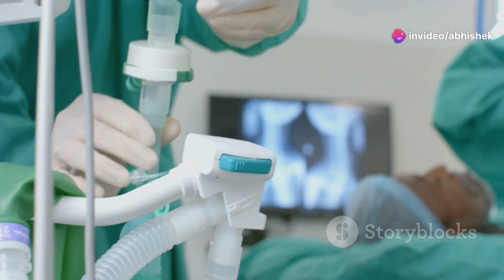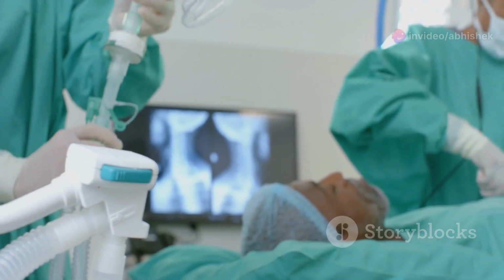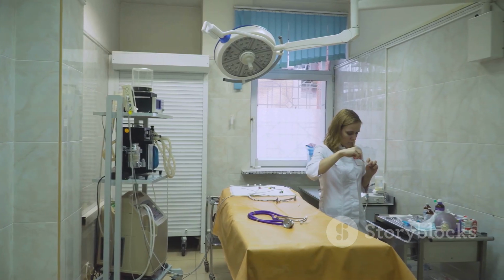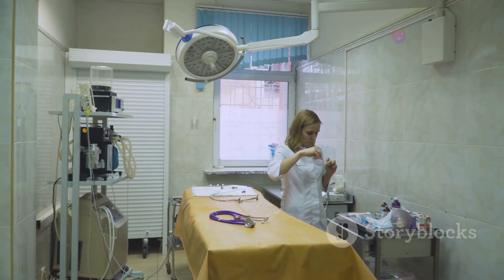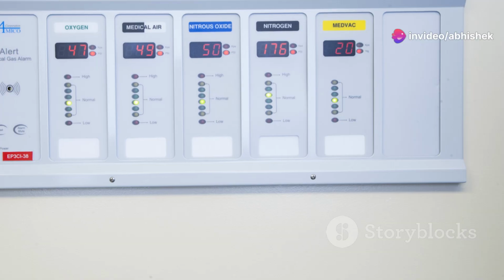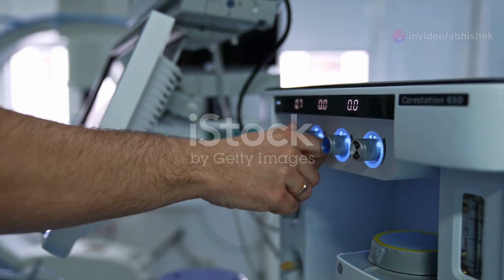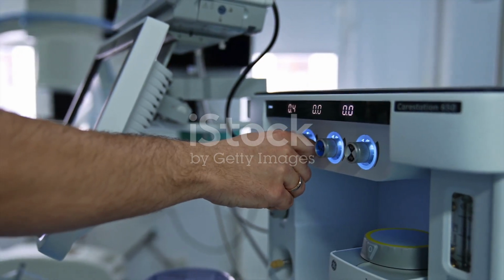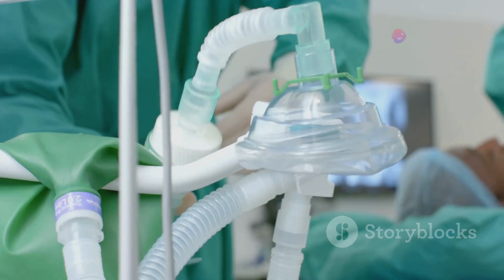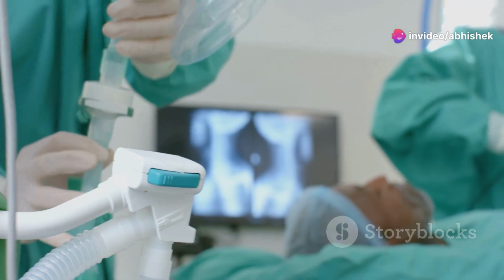Anesthesia machines are incredibly safe when used correctly, but like any complex medical device, there's always a chance something could go wrong. That's why we have alarm systems, our trusty sidekicks, that are always on high alert, ready to warn us of any potential issues. These alarms are designed to grab our attention if something isn't right. For instance, if the oxygen level drops too low, the ventilator malfunctions, or the patient's blood pressure plummets, the alarm will sound, giving us precious time to troubleshoot the problem and keep the patient safe.